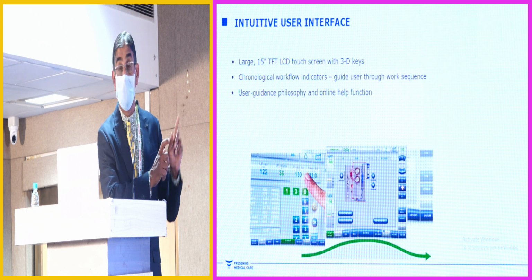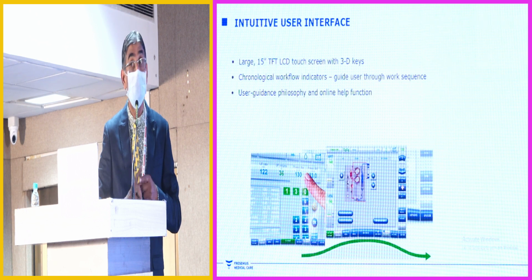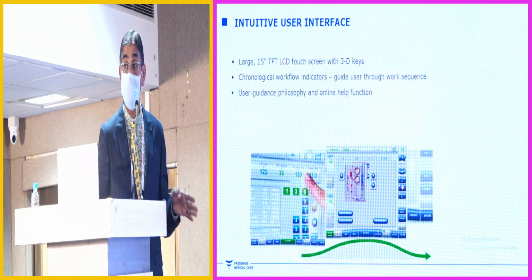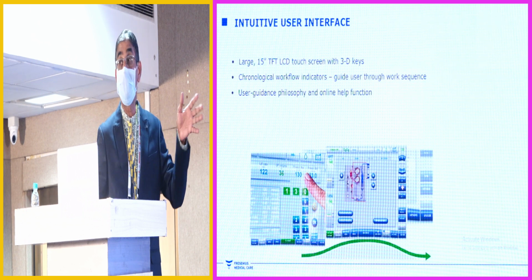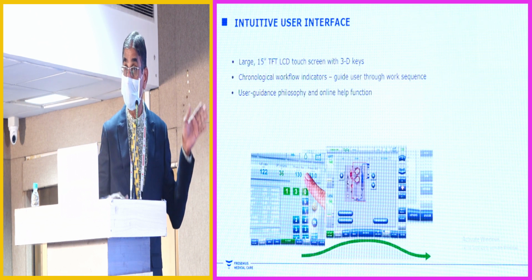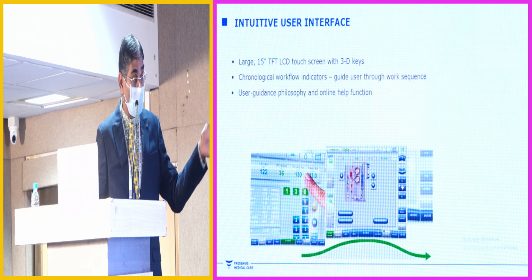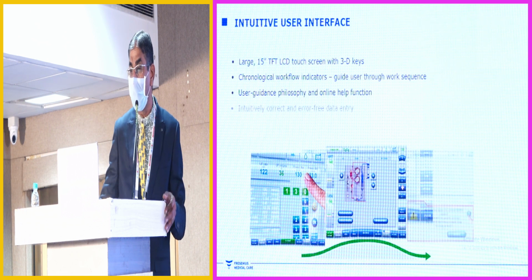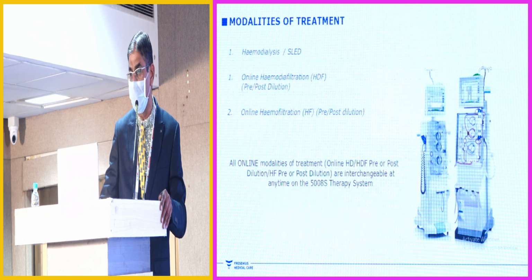You need no saline. You don't require an IV set. This is automatically manufactured online with your acid and bicarb. In between you have the RO water. You have a mixing of 1 part of acid, 32.775 liters of RO water plus 1.225 of bicarbonate. All will mix, it's 1 plus 34.